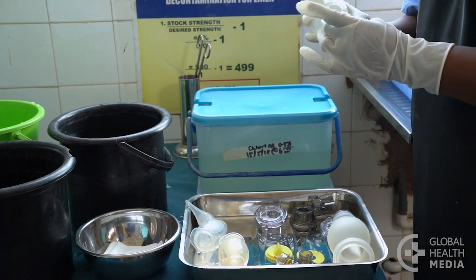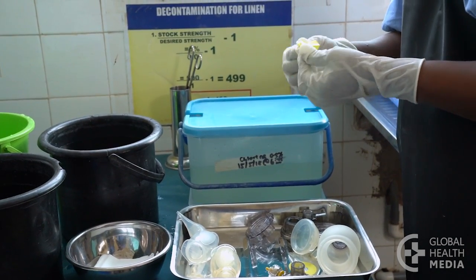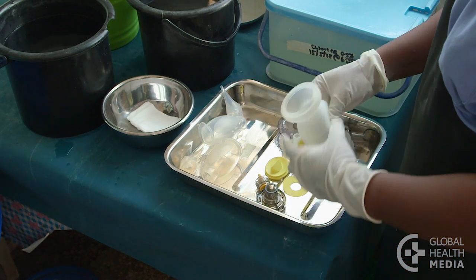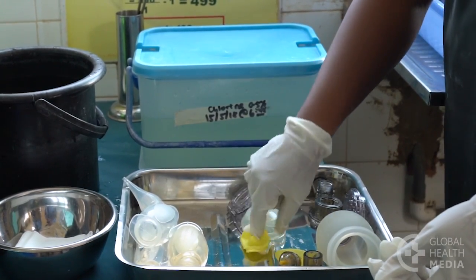Now you've disinfected the equipment. Wearing sterile gloves, inspect each piece for damage, and then count the pieces for each ventilation bag. Repeat the cleaning process if they are not clean, and replace any damage or missing parts.